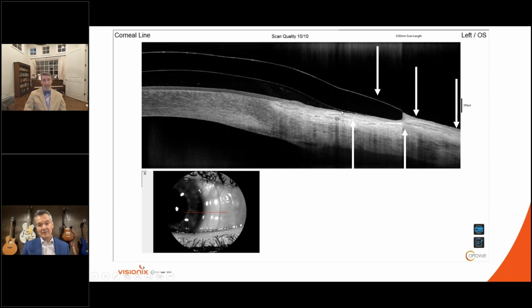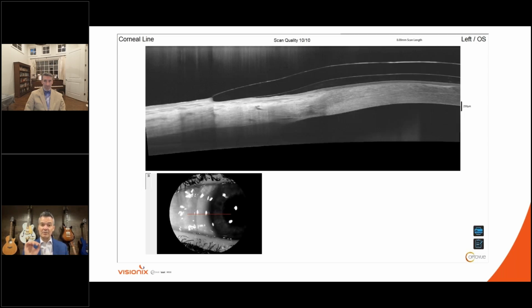You can see this through the subtle little lift occurring in the landing zone right here. Those are things we need to be cognizant of. This gives us indication that the most distal portion of this lens will likely need to be lifted or elevated just a little bit.